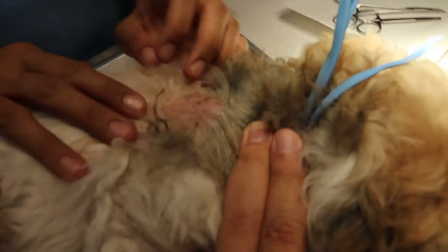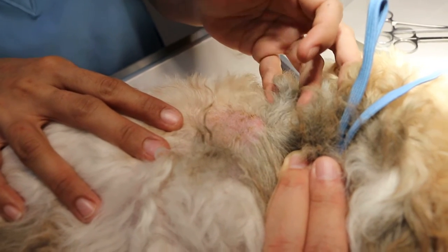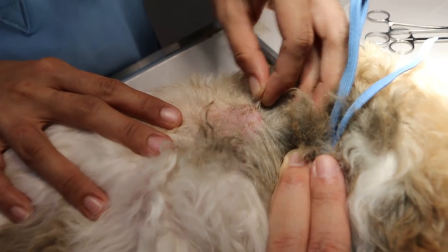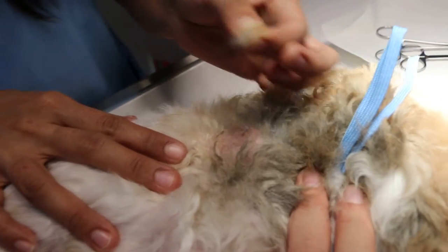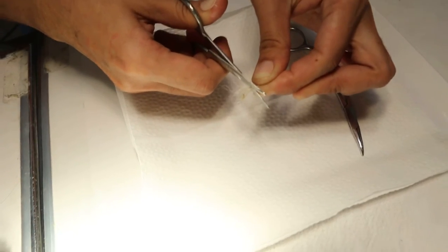She will use her fingers and thumb to pull the hair on the periphery of the ring — about 2cm — and then cut it using the scissors, cutting the lower end, about 2cm.